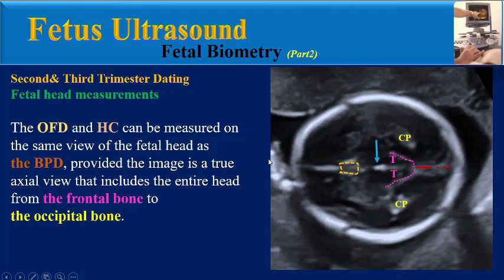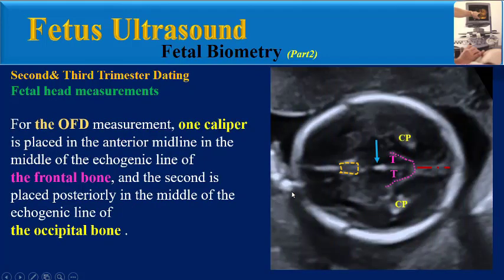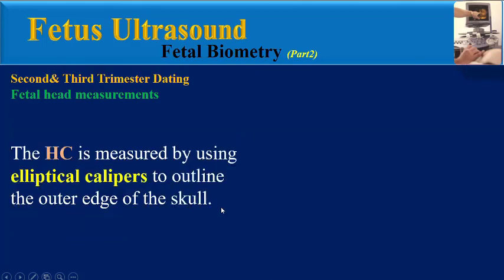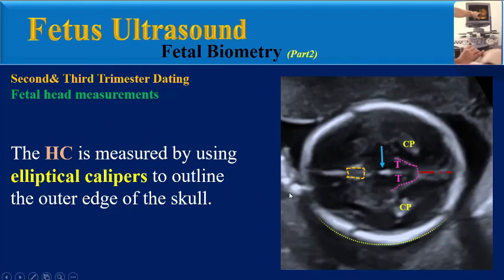The OFD and head circumference can be measured on the same view as the BPD, provided it is a true axial view including the entire head from the frontal bone to the occipital bone. For the OFD measurement, one caliper is placed in the anterior midline in the middle of the echogenic line of the frontal bone, and the second is placed in the middle of the echogenic line of the occipital bone.